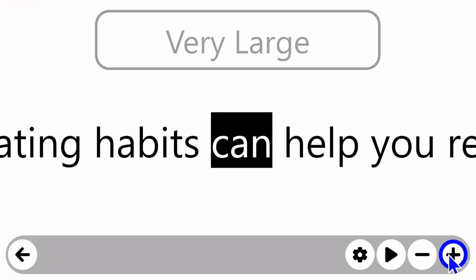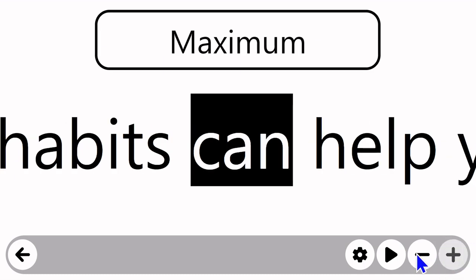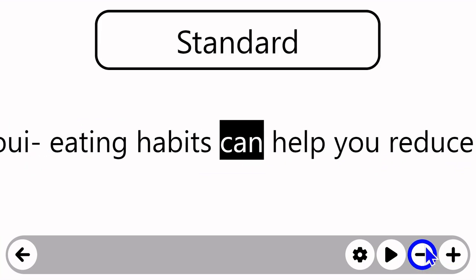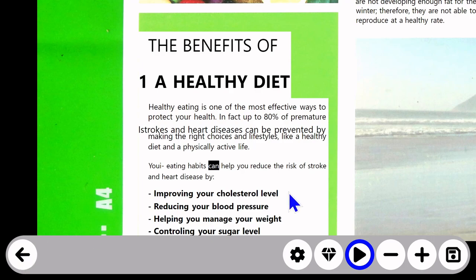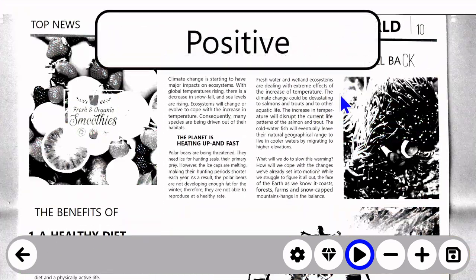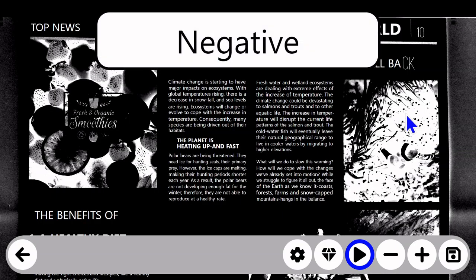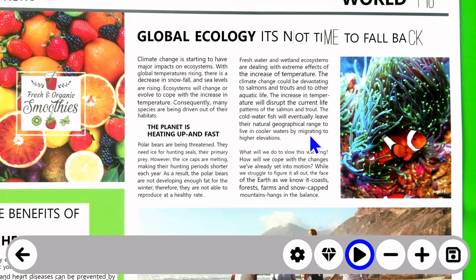In addition, you can click on your plus and minus to increase your font size for that line reading mode as well. So those tools are available to you when you're having a document read aloud. Let's use the back arrow all the way to the left of this toolbar, and we will return out to our document here, which we can then again zoom, and we can click and drag it around. We can zoom, click and drag on the right of the screen here to change our contrast colors.